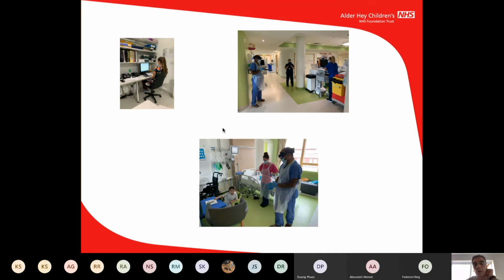Again, we just tested yesterday and the day before. Samantha, I think one of the SHOs, was telling the registrar what was in the Meditech, and he could see a hologram of the Meditech in front of him, so he could see, all right, the urea and the X-ray look like that. We have tests with echocardiograms, etc. So we're probably going to plan something much better, but this was just testing how it's going to work.